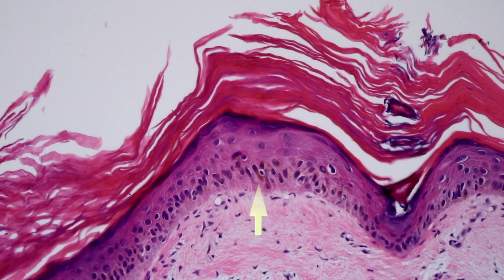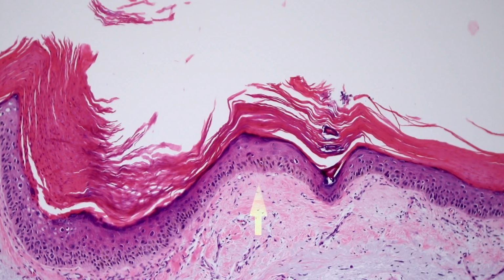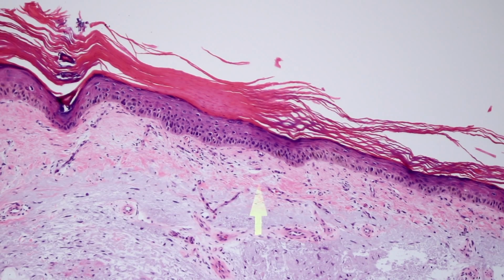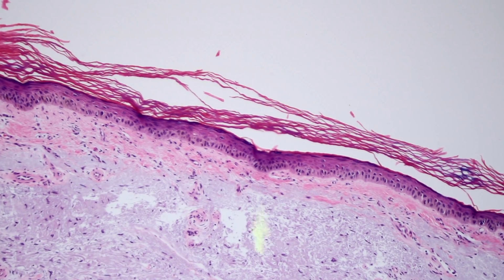There's melanin pigment. So sometimes actinic keratoses can be quite pigmented, and when they are, occasionally, especially if they're not very scaly, clinically they can sometimes resemble melanoma in situ. And so they may be biopsied with a differential of rule out lentigo versus lentigo maligna type of melanoma in situ. So here, notice the basal layer here is kind of pale and different colored from the rest of the epidermis. And it's a little bit of that jumbled, hypercellular, a little bit atypical.